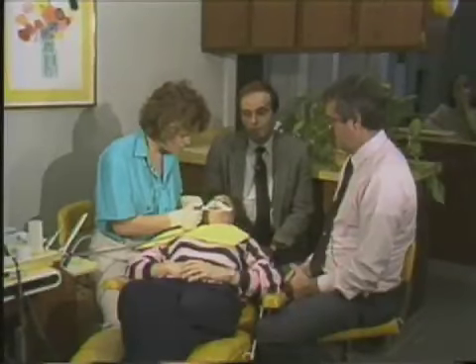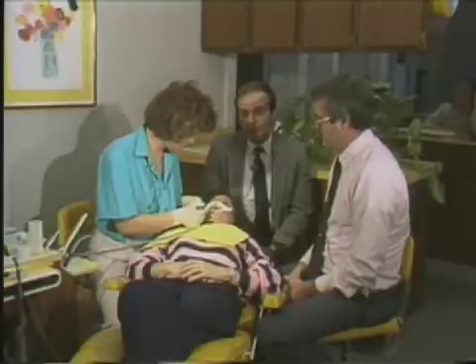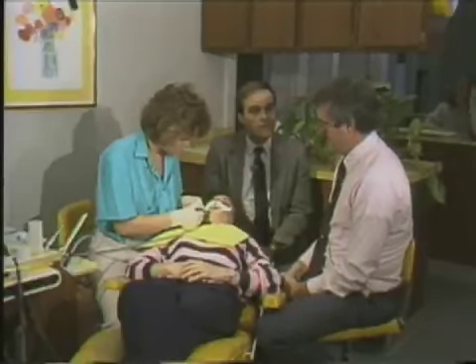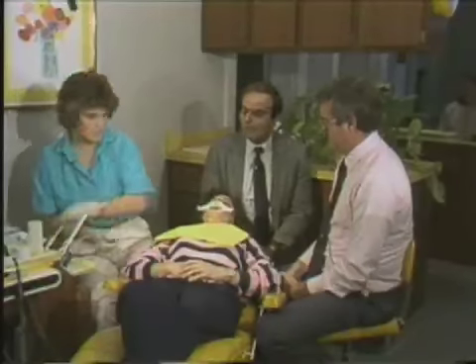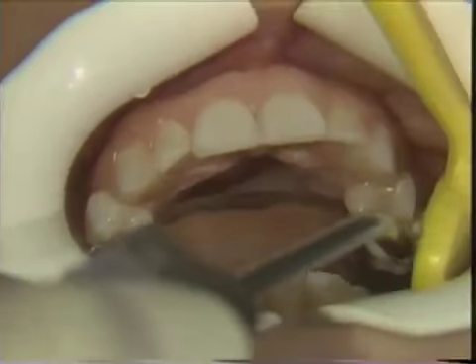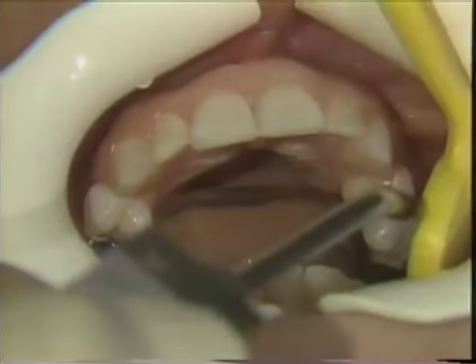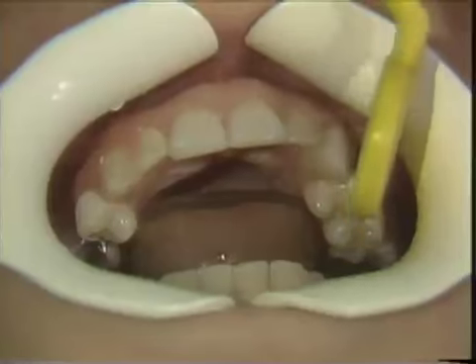If it appears chalky in some areas and shiny in others, that's the instance of having a pellicle still on the enamel. In that case, that tooth should be scaled and then re-etched. If the tooth has a yellowish appearance to it, that means there's tartar still on that enamel surface, and that must also be scaled and then re-etched from there.